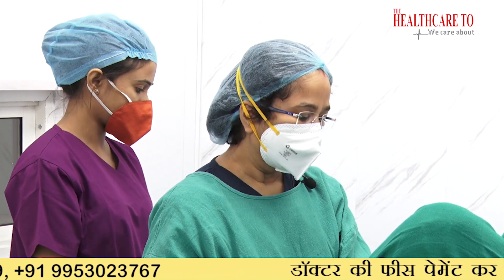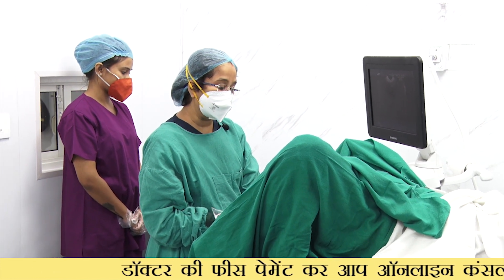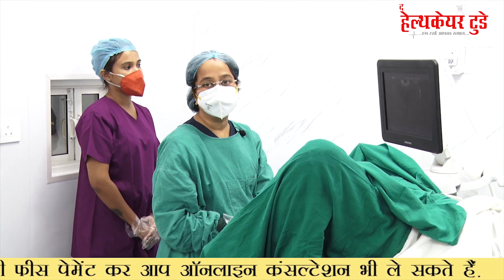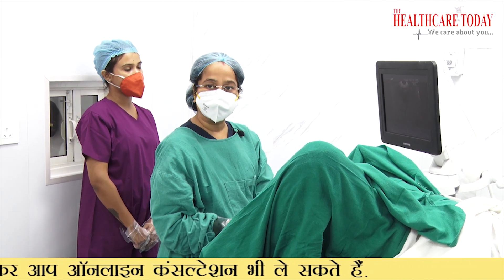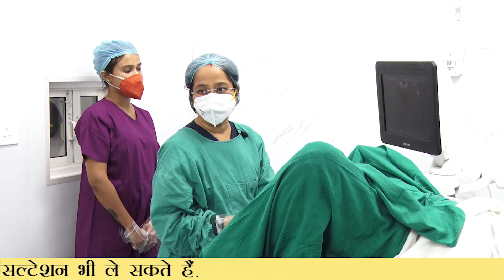You press the button and the follicular fluid starts coming. You have to be very particular — you cannot keep pricking the eggs carelessly because the oocytes will get disturbed. You have to aspirate in a careful manner so that the oocytes come out of the ovaries; otherwise they will remain attached in the follicle, resulting in empty follicles. So be very particular about how you are aspirating the fluid.